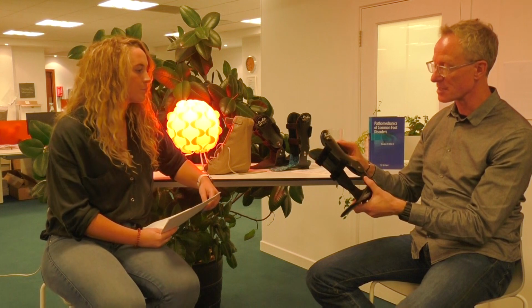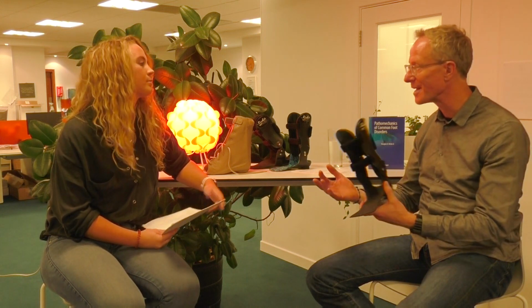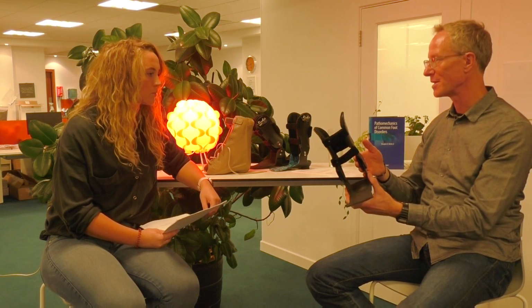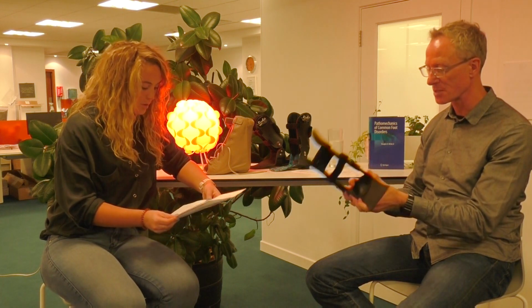And that's something you need to explain to your patients, that in the same way that perhaps they get their shoes mended, these items need to be replaced. And particularly when you're dealing with the severe pathologies, you will get wear on these at the lateral side or on the medial side, depending on the pathology and the diagnosis.